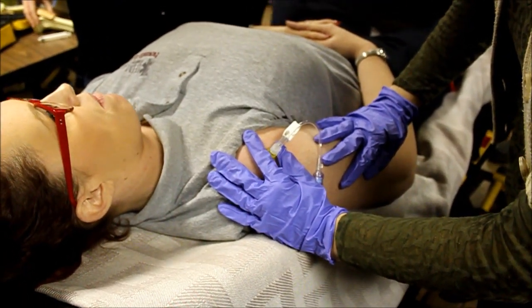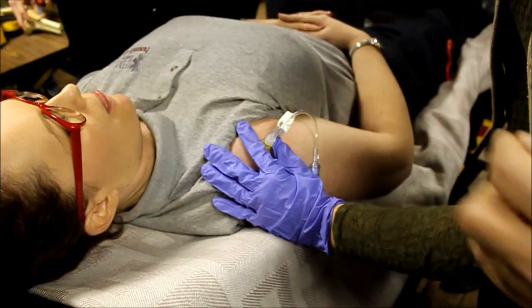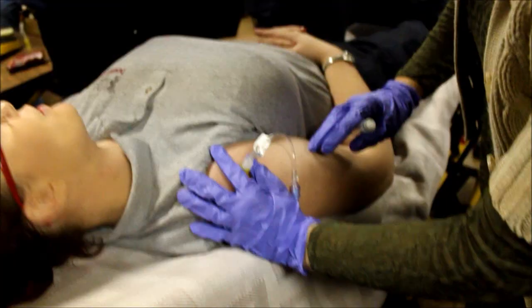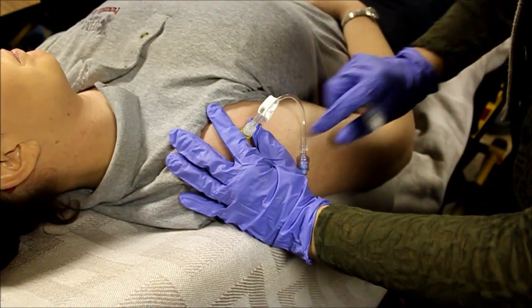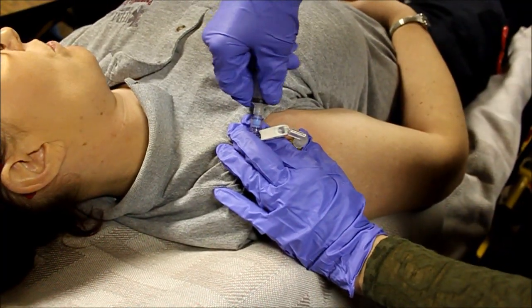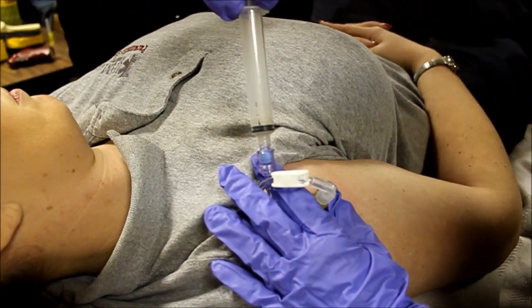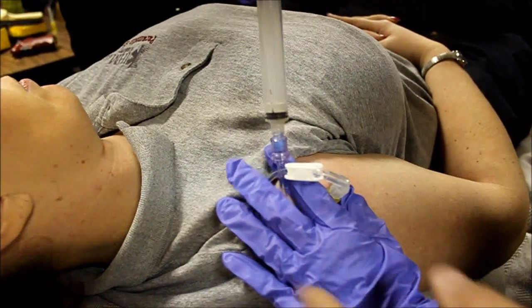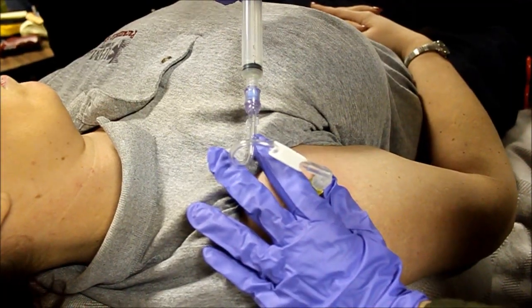Do you want to have her try to draw back some blood? Yeah. It hurts a little bit more sometimes — if she does it slowly? Do you feel like you're firmly embedded in there? Yeah, good. Can you feel that when you hit your funny bone? That's exactly what people say a lot — that's exactly what it feels like. Hook up the syringe to your extension tubing; it's a standard luer lock. Very, very slowly pull back — don't do it rapidly because it will hurt. Sometimes the plunger gets stuck at first, so be careful it doesn't give on you really fast. Aspirate slowly and look at the tubing and see if you get blood return. You may not, but when you do, it's just one way of confirming that you're in it. I don't see anything.